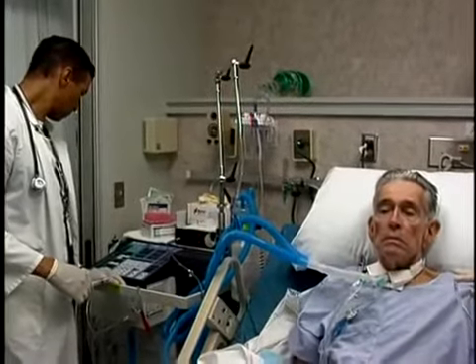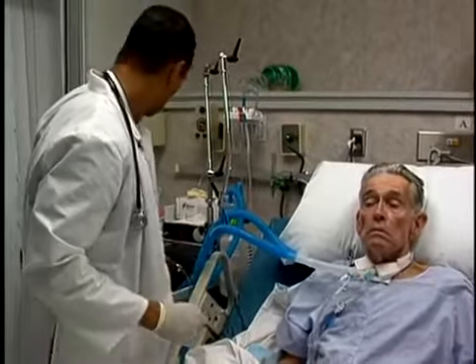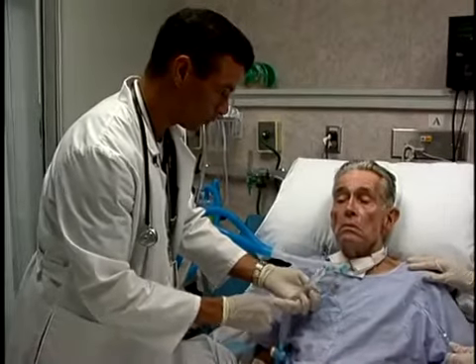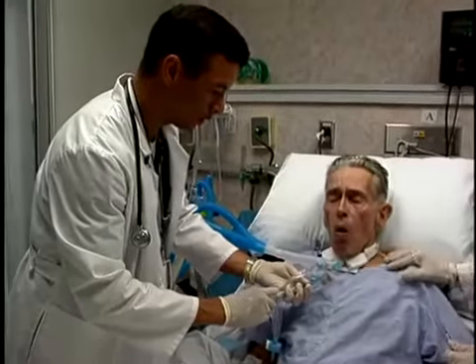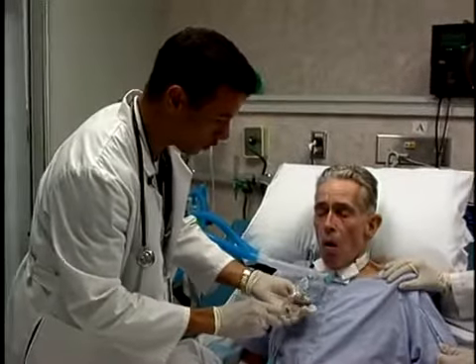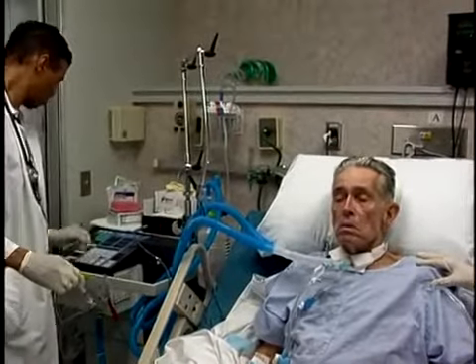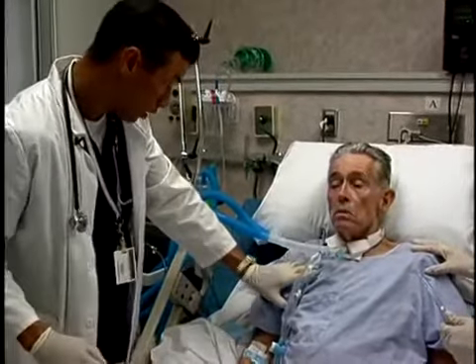As you deflate the cuff, continue monitoring peak pressure. If the pressure should drop, increase tidal volume in small increments to maintain the previous level of pressure per physician direction. However, when a significant drop in pressure occurs, it is recommended that you re-inflate the cuff and begin a slower cuff weaning procedure. A large drop in pressure indicates that the oropharyngeal muscles lack sufficient tone to allow appropriate ventilation with the cuff deflated and will require further intervention.